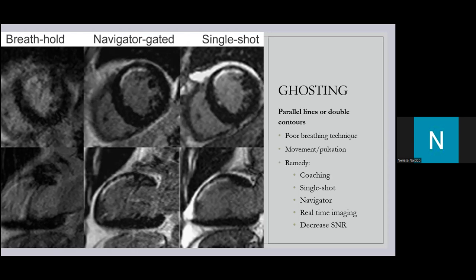So we are going to go through another slide where I will go through all the measures we can take to ensure that your patient doesn't move on the table. But we also have to remember that we are doing a cardiac scan, and quite often these patients are already compromised. They are already struggling to breathe normally. They are experiencing shortness of breath. They are uncomfortable. They are in pain, and it's worse when you are lying flat.